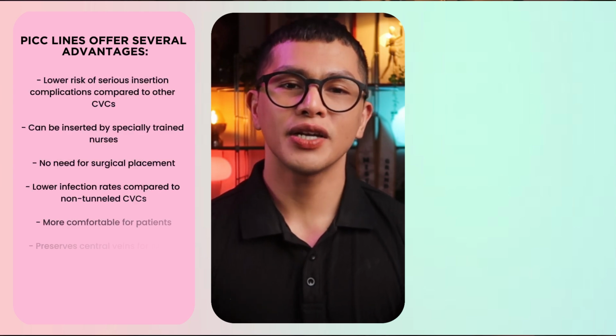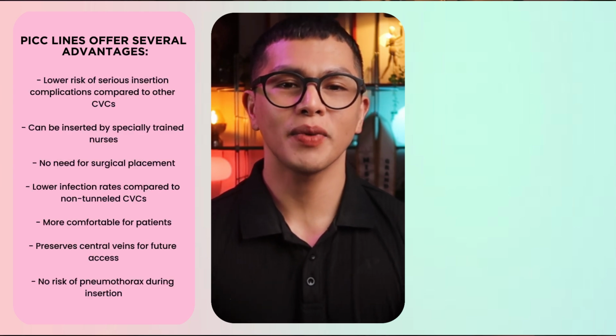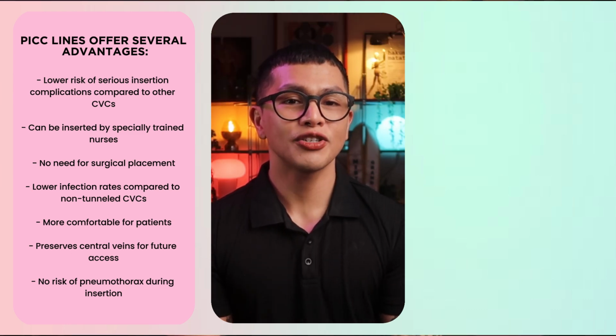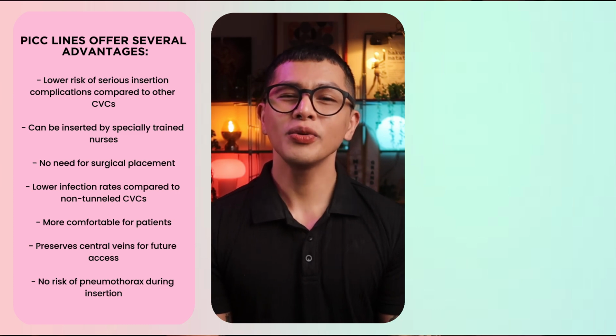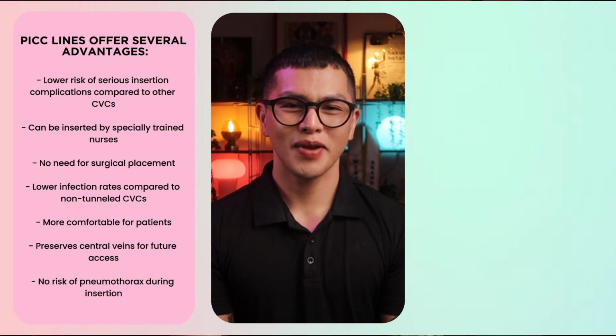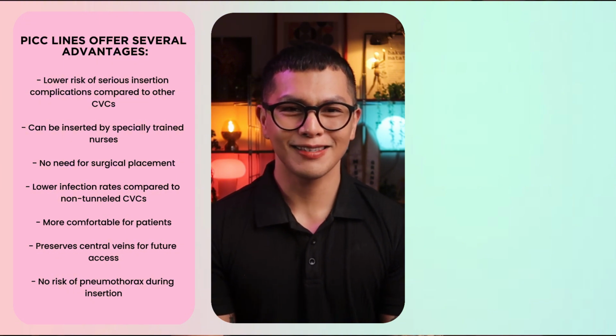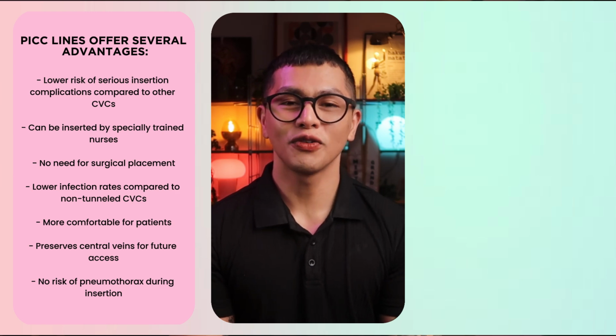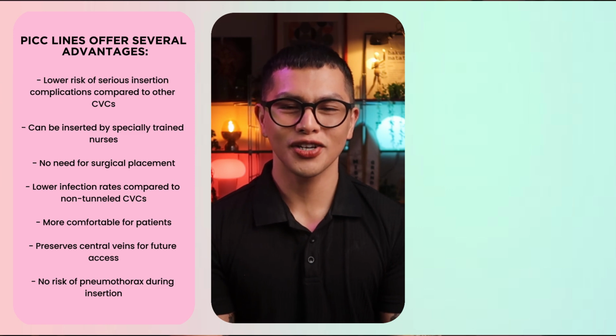Lower risk for serious insertion complications compared to other CVCs. Can be inserted by specially trained nurses. No need for surgical placement. Lower infection rates compared to non-tunneled CVCs. More comfortable for patients. Preserve central veins for future access. No risk for pneumothorax during insertion.